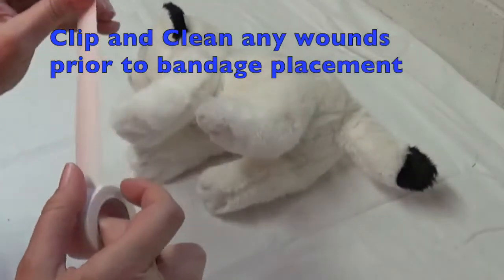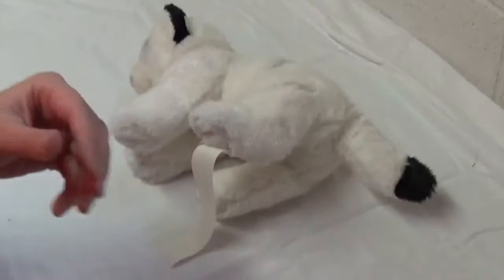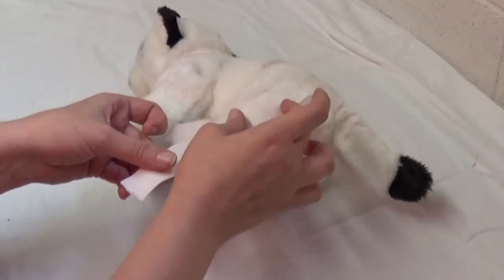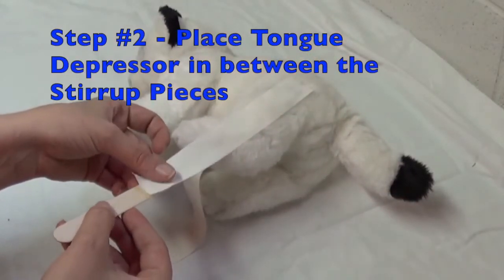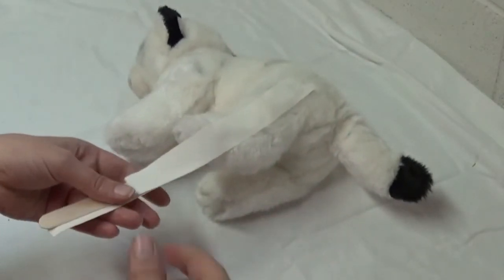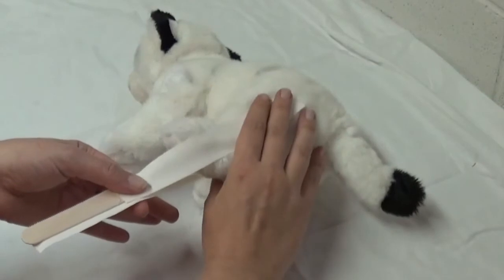The first step to place your modified Robert Jones — and this goes for a lot of bandages — is to place your stirrups. The stirrups are the main part of your bandage that will help keep it on. If you forget to put your stirrups on, the bandage is going to come off. If the patient has a wound, be very careful not to place the tape over the wound. Take your tongue depressor and place the ends of your stirrups on that — the only reason being to help the tape not stick to itself. It can also be helpful if you need a little retraction as an assistant.